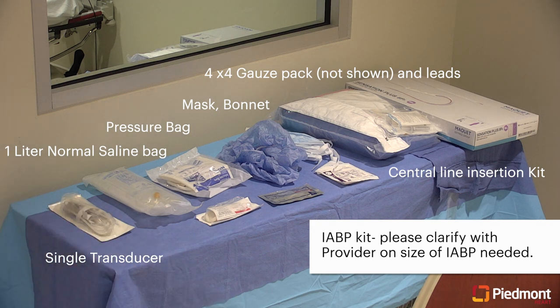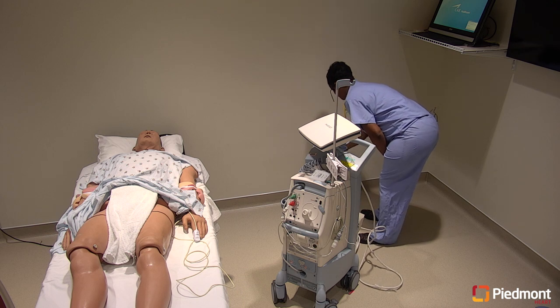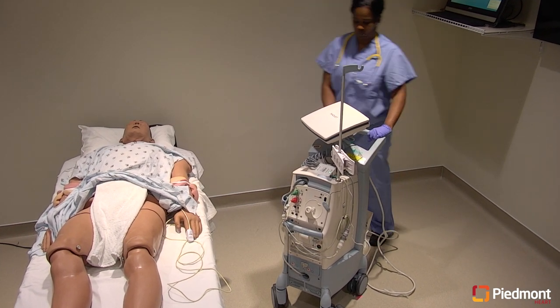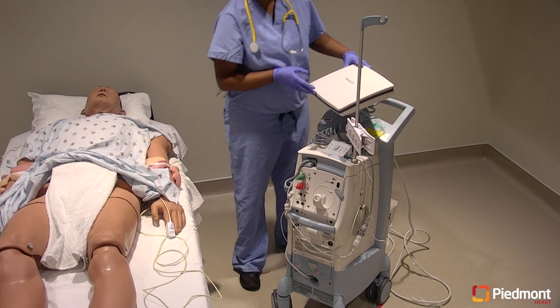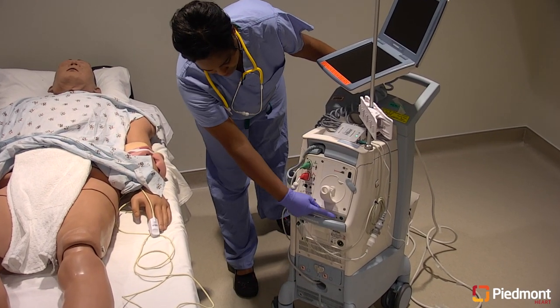In some cases, providers may prefer to bring the central line kit, sterile gloves, and balloon pump kit themselves. Clarify before you assume. Begin by plugging in the balloon pump console and positioning it out of the way but accessible to you. The end of the bed is preferred, often on the right side, but for the viewing sake of this video, we have set it up differently. Turn on the machine.